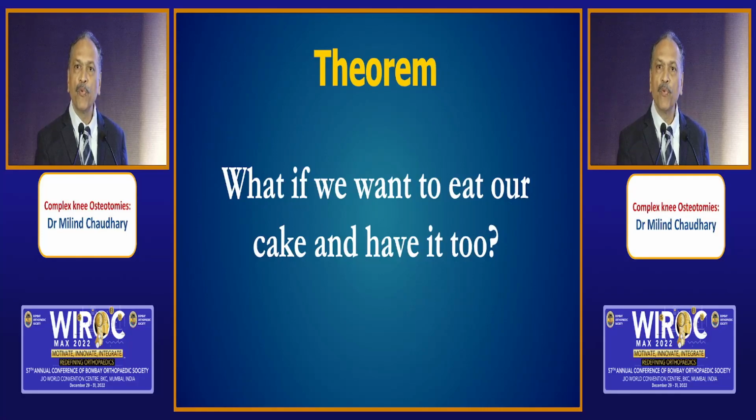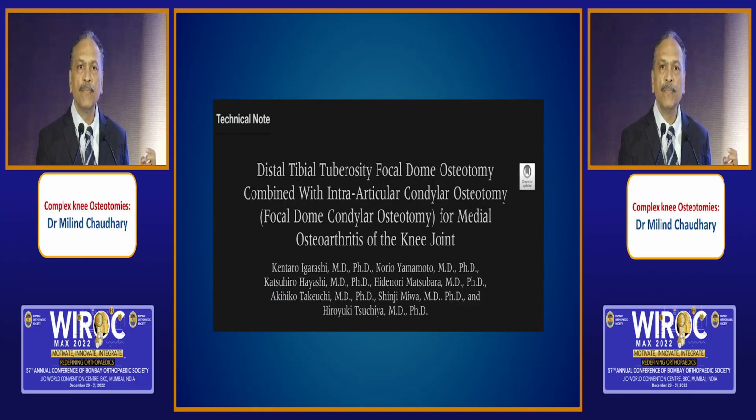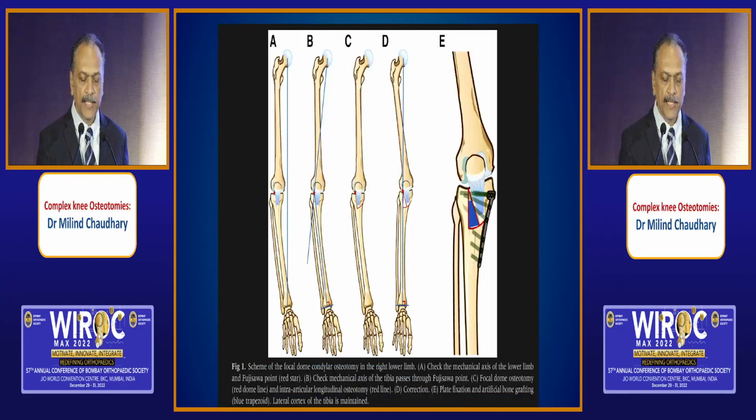Now, what if you want to have your cake and eat it too? Here comes focal dome condylar osteotomy. An elegant two-in-one option came from Kanazawa City, again Japan. Professor Tsuchiya, Igarashi and Tsuchiya. Here, the osteotomy is a little different.